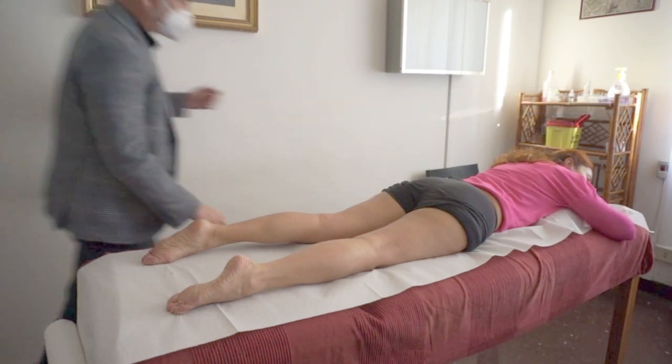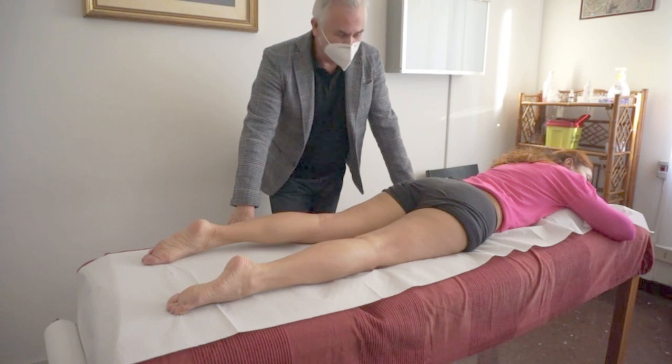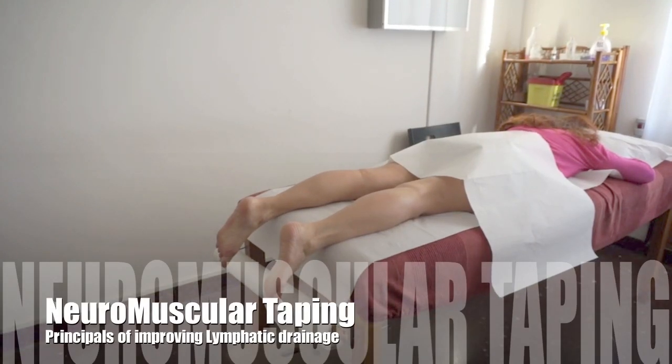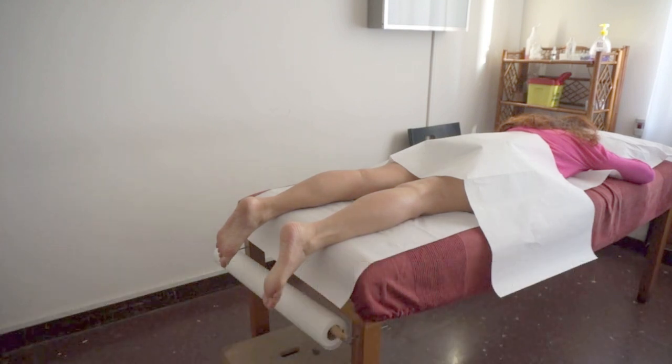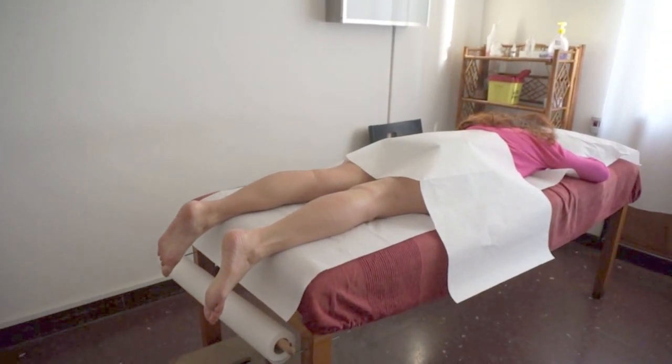Good morning everyone joining for this Lymphedema Day in Argentina. My name is David Blo and I'd like to take you through some of the principal steps in applying neuromuscular taping for improving lymphatic system activation and functioning.